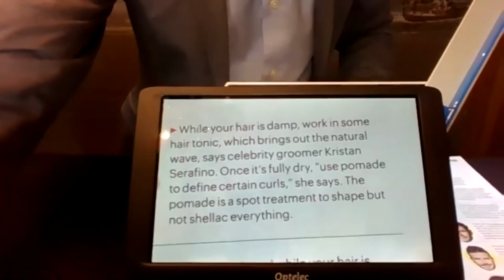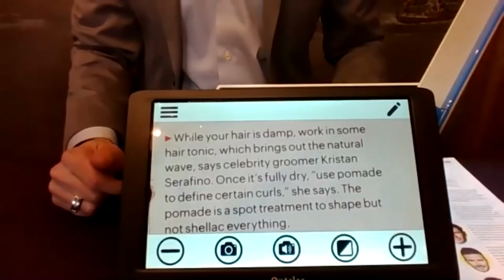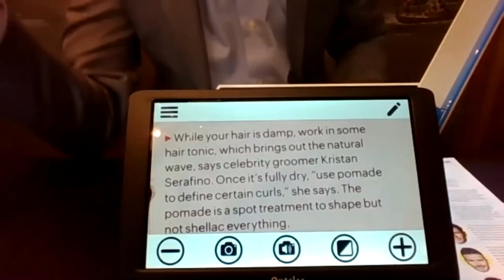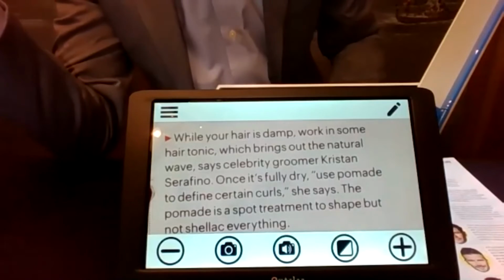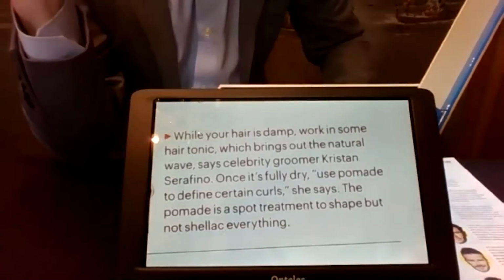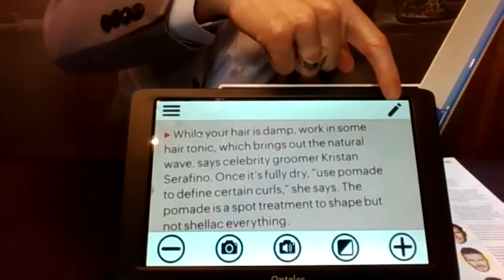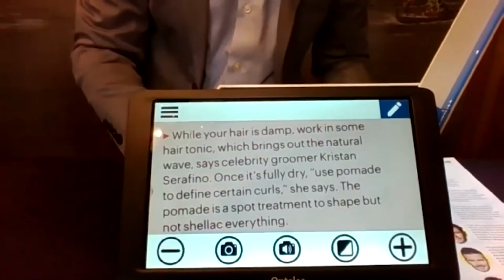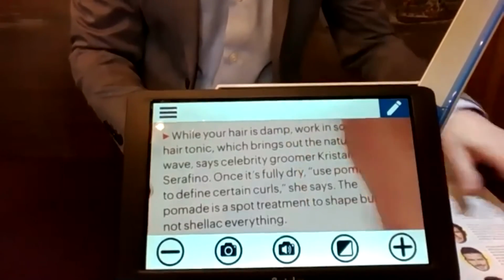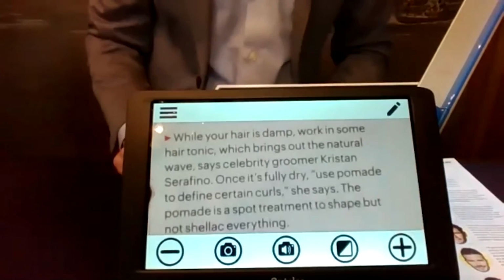The other thing I do want to point out, we mentioned filling out forms and whatnot. I was going to show a check, but I'd be giving everybody my account and routing number and all that stuff, right? Which, if you deposit, the other way around, yeah, exactly. I don't know if I want to do that. So this does have a focus lock here as well. We can tap that, and that's going to keep the focus on the material that you're writing on. That was also a thought that they added in there.